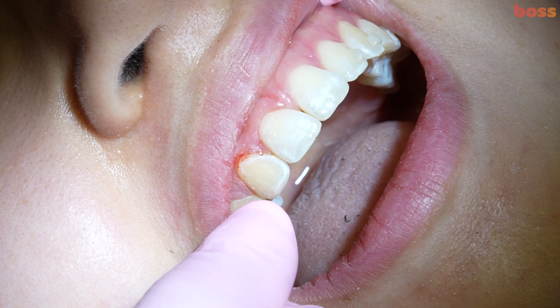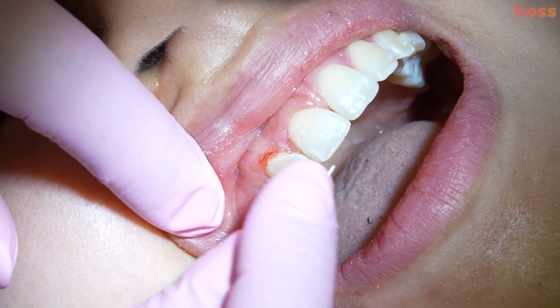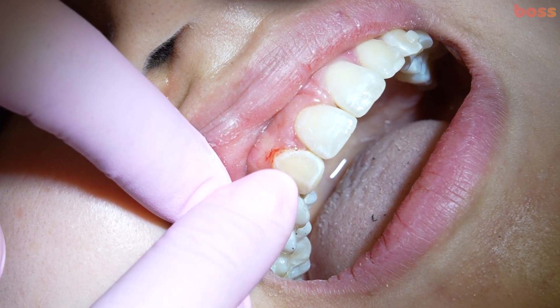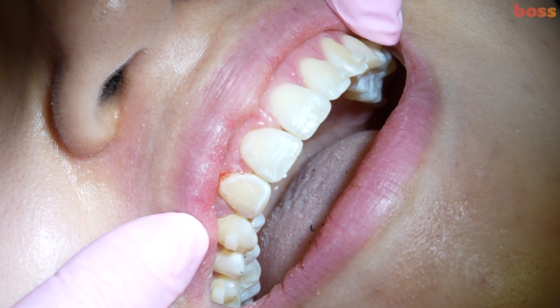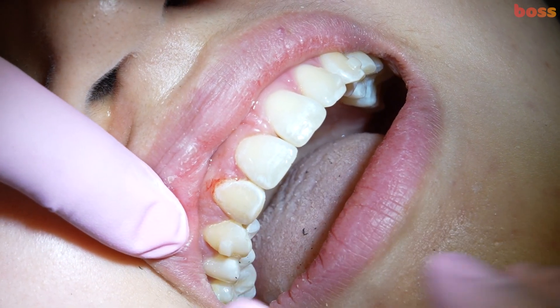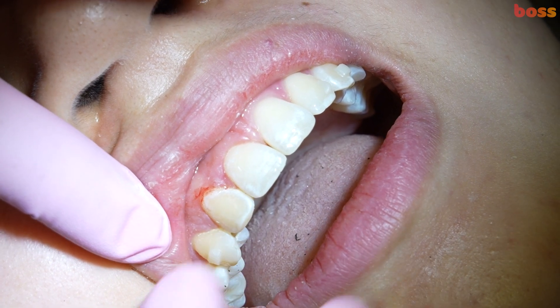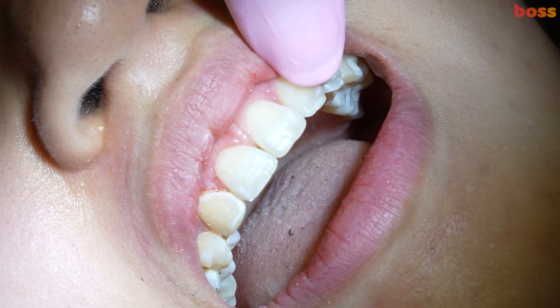It is still a very convex and yellow canine. So what we're going to do is start some early whitening just as the patient is finishing — adding whitening gel just on that tooth to start lifting the color. Eventually a restorative dentist can build us a nice marginal edge with the exact contours of the tooth, since this is still quite a bulky, curvy tooth.